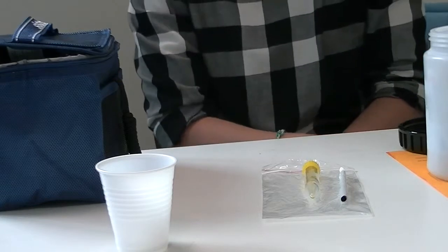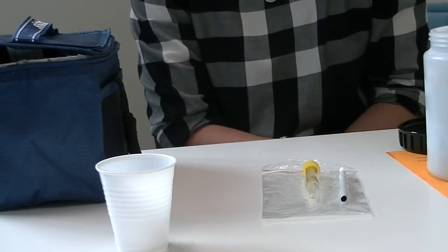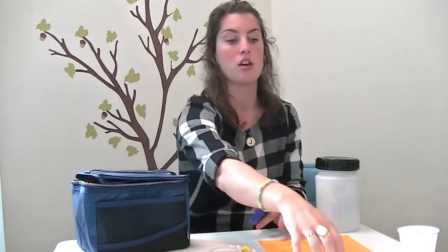Once you've received your saliva collection kit, we need you to store the biobottle in the freezer until the morning of your visit. We've given you a stopwatch to see how long it takes to collect your saliva. We've also given you a cooler bag to put your biobottle in when you're coming to give us your saliva sample at the hospital. You've also got an orange sheet of paper to fill in some information about your saliva.